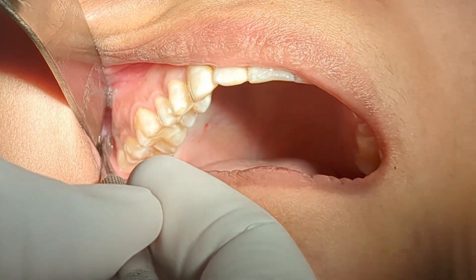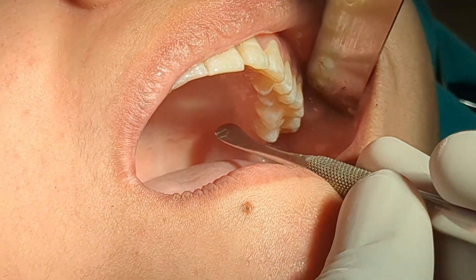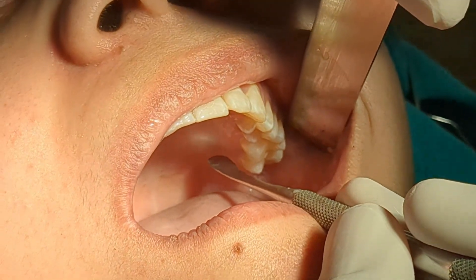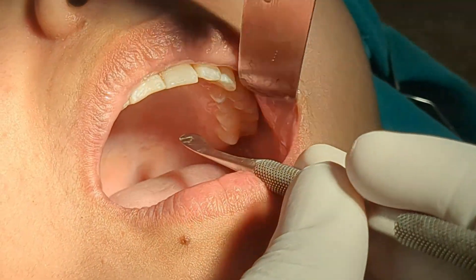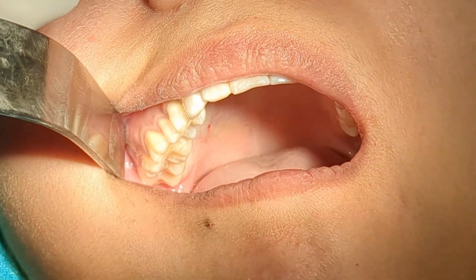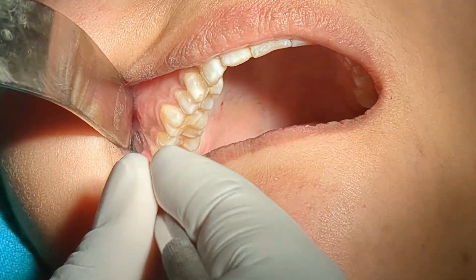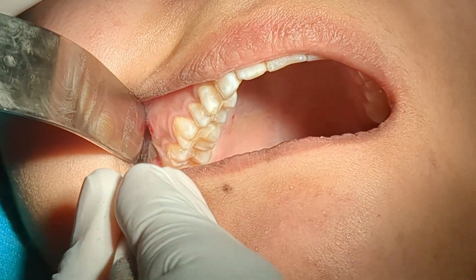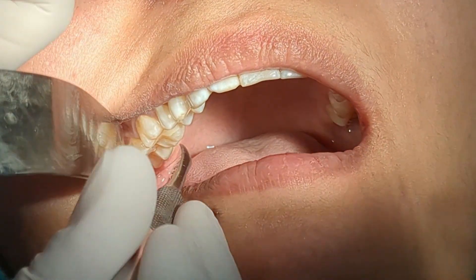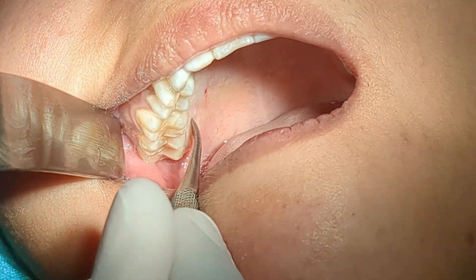Even after a successful nerve block, many times a patient is not able to differentiate between pain and pressure. To make sure that the patient can differentiate between pain and pressure, I lightly poke the tissue on the contralateral side to show the patient what actual pain feels like. Then I check on the side where I have given the nerve block. As the patient has already experienced the pain on the contralateral side, he will be able to differentiate pain from pressure. The patient does not have any pain on instrumentation.